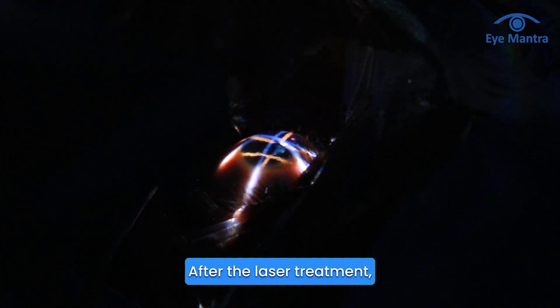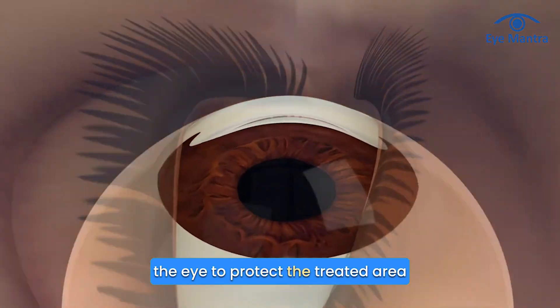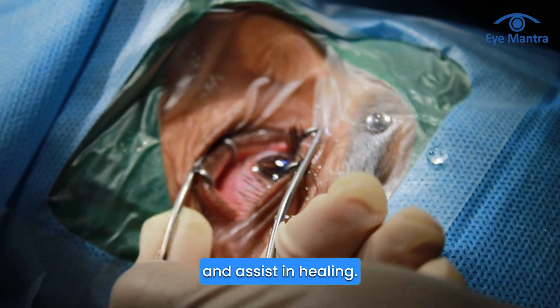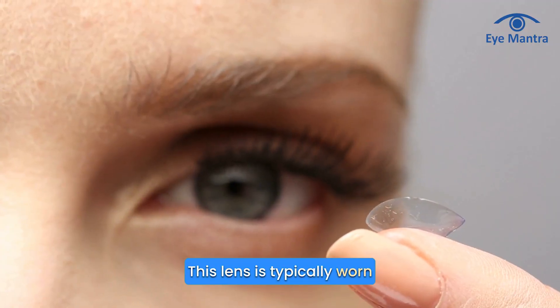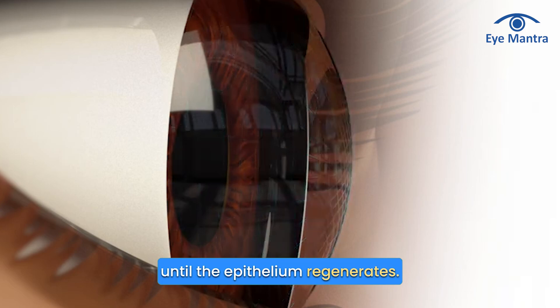After the laser treatment, a soft contact lens is placed over the eye to protect the treated area and assist in healing. This lens is typically worn for three to five days until the epithelium regenerates.